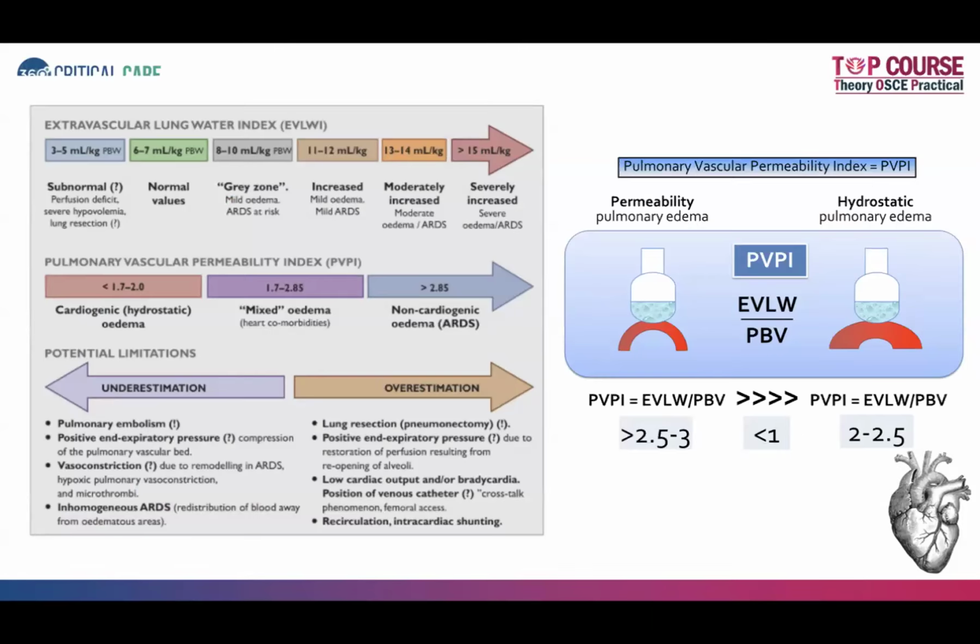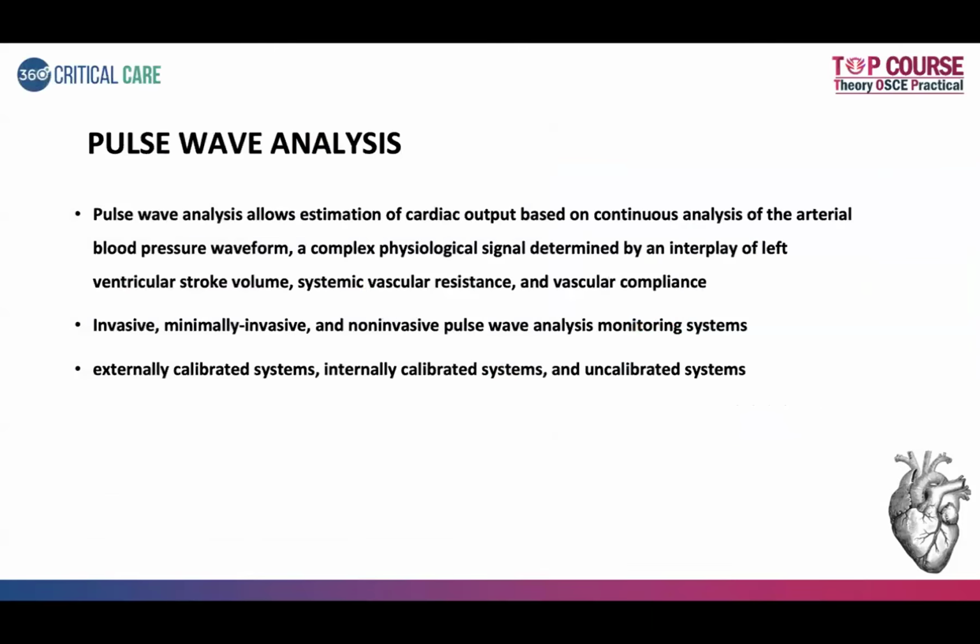Coming on to, so we saw the minimally invasive technique, the transpulmonary thermodilution. The second method we are coming on to is pulse wave analysis. Pulse wave analysis allows estimation of the cardiac output based on continuous analysis of the arterial blood pressure waveform, a complex physiological signal determined by an interplay of left ventricular stroke volume, systemic vascular resistance and the vascular compliance. So it could be invasive, minimally invasive, or non-invasive.